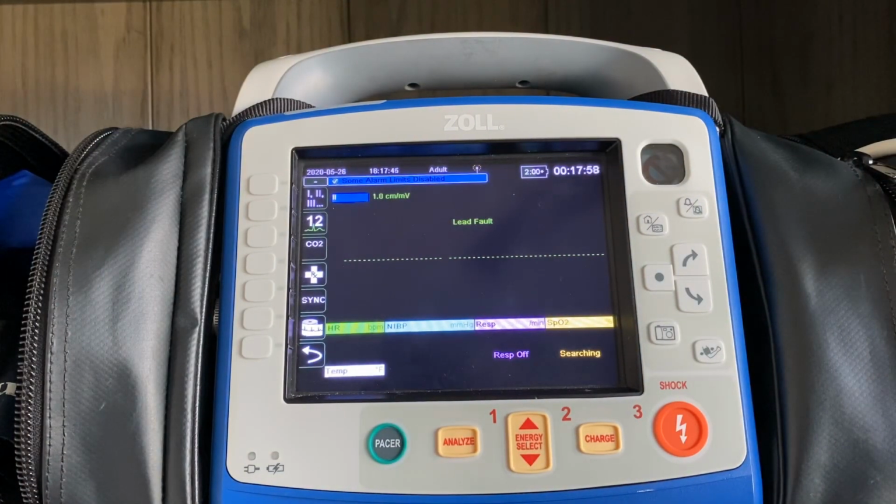So what we talked about was, on a cardiac arrest patient, whether or not you saw a waveform on the screen, right? That dictated whether or not you had properly intubated that patient. In this case, on a respiratory distress or sepsis call, you're going to see all different shapes of waveforms on the screen, and the shape of that waveform is going to determine what's causing the distress on the patient. So an asthmatic patient, for example, is going to present a shark fin-shaped waveform.